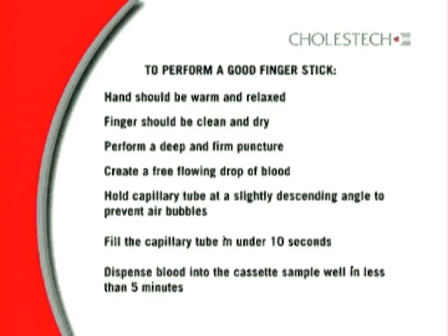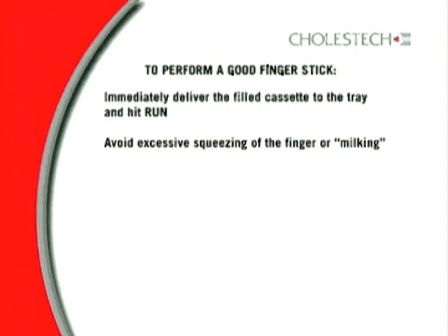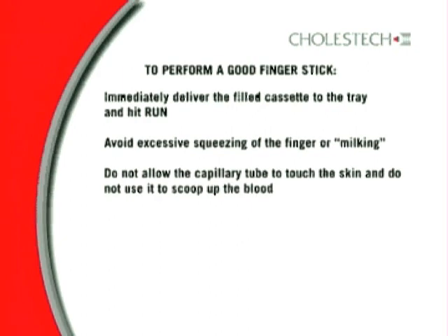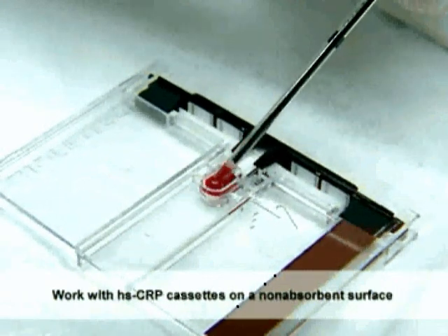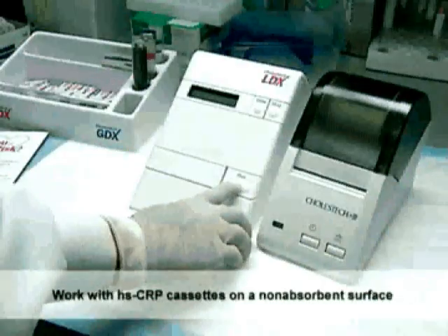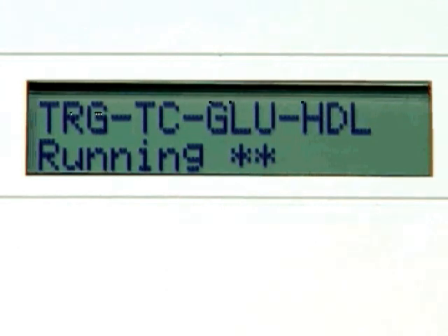Dispense blood into the cassette sample well in less than 5 minutes and immediately deliver the filled cassette to the tray and press Run. Avoid excessive squeezing or milking of the finger, as this may dilute the sample with tissue fluid and cause it to clot faster, leading to inaccurate results. Do not allow the capillary tube to touch the skin and do not use it to scoop up the blood. Avoid air bubbles in the tube — if there is air, you may not have enough sample and must start with a new capillary tube. Dispense the sample toward but not touching the white material in the cassette well. Hold the cassette horizontally and do not touch the black bar or the magnetic stripe. Press Run to close the drawer and start the test. Dispose of all supplies contaminated with blood in a biohazardous waste container.